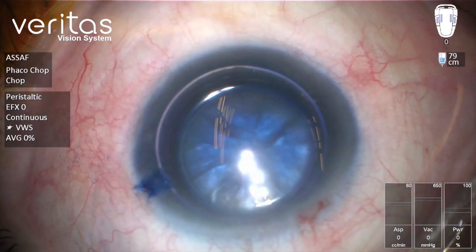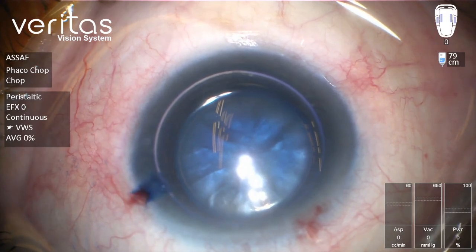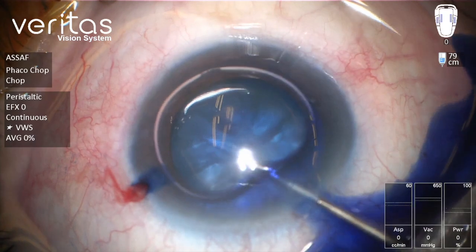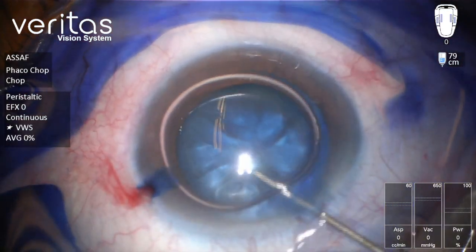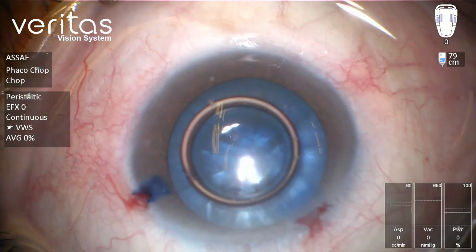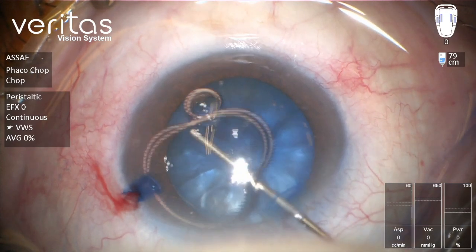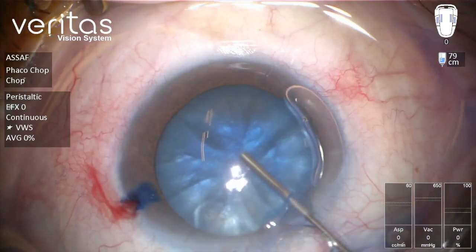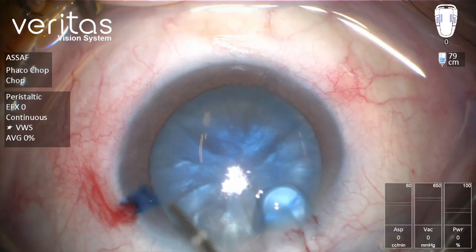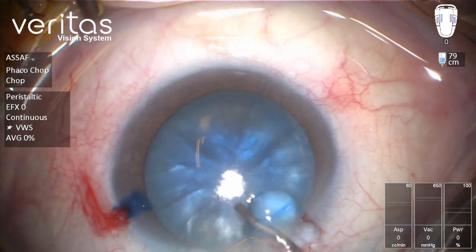Now we're going to wash the stain, followed by injection of OVD. As you can see, there is some liquefied cortex underneath the capsule wash.